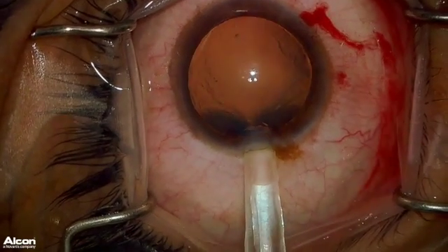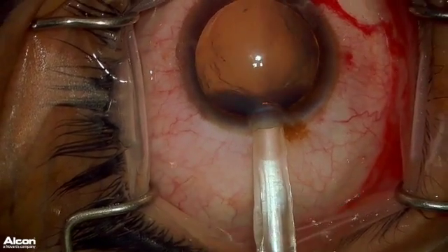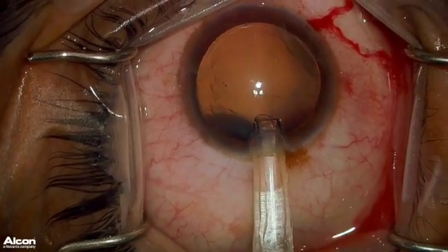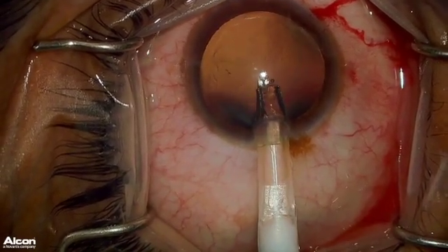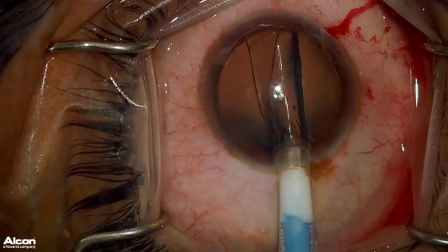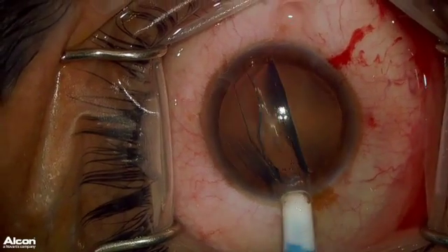I am now injecting the ICL into the eye and everything seems to be going well. The ICL begins to unfold, and everything looks like it is going perfect, and then all of a sudden the ICL starts to flip.